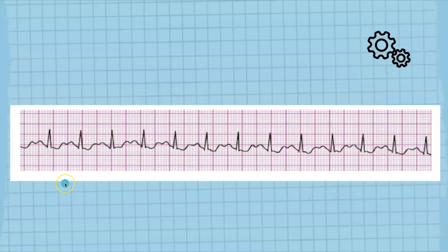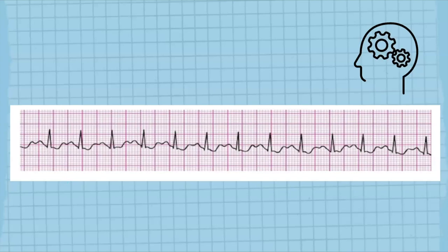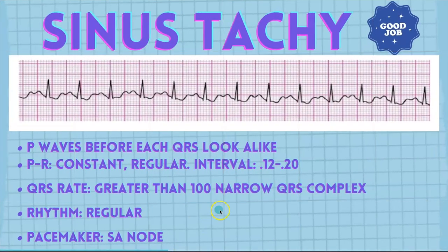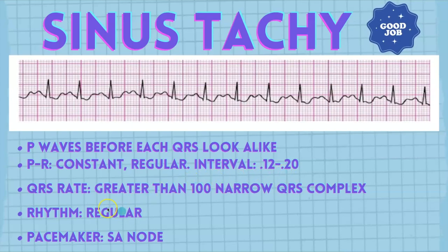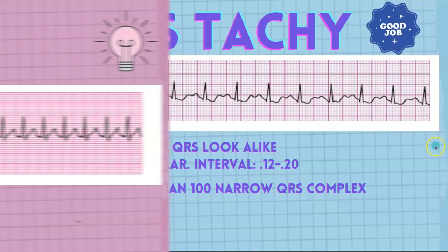So the heart rate is about 130 per minute. So if it's that high, what are you thinking? If you said sinus tachycardia, you are correct. P waves before each QRS — they look alike. The PR is constant, with a regular interval of 0.12 to 0.20 seconds. The QRS rate is greater than 100, there are narrow QRS complexes, the rhythm is regular, and the pacemaker is the SA node.